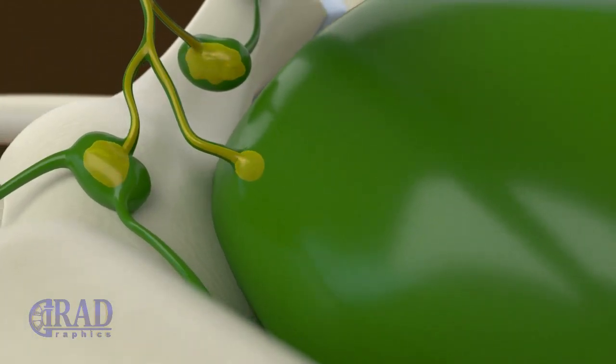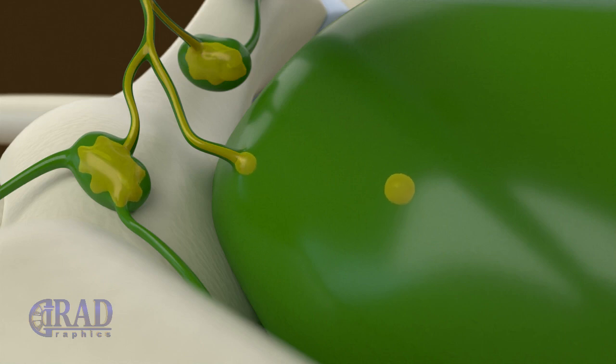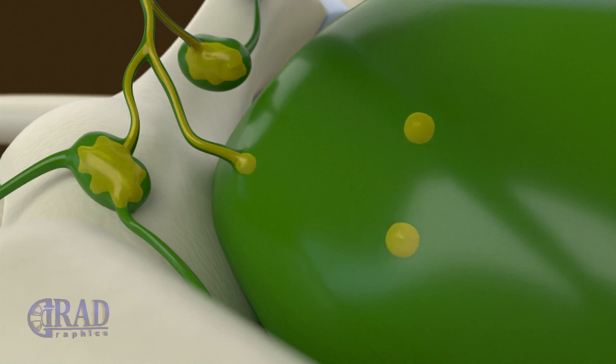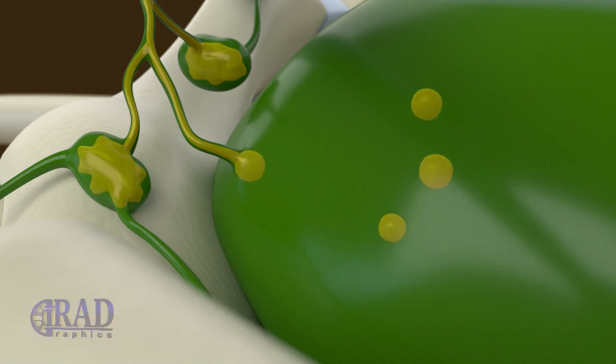The contrast droplets are a good indicator of the leak location, as is shown here.